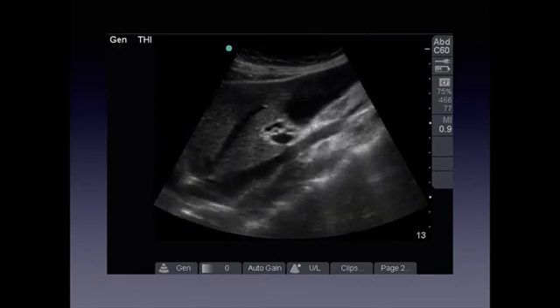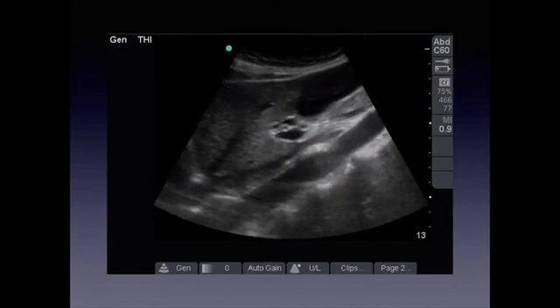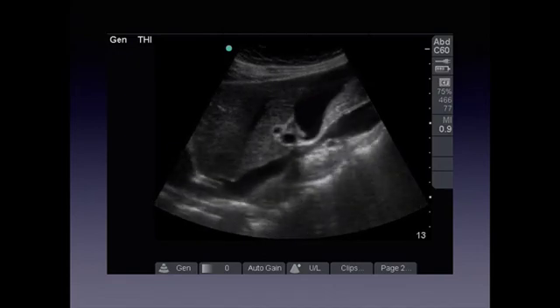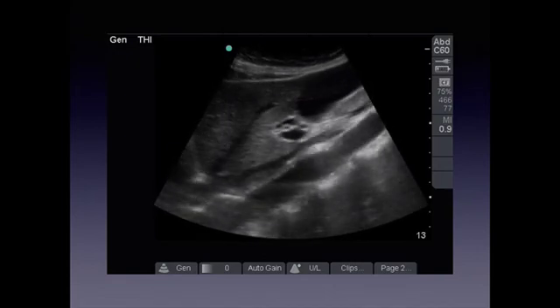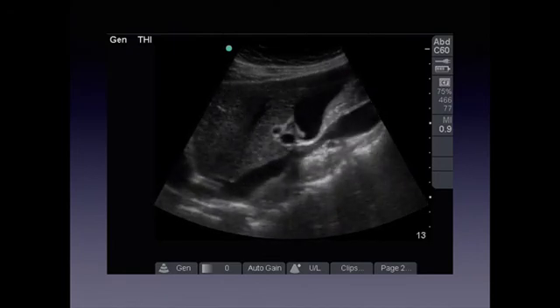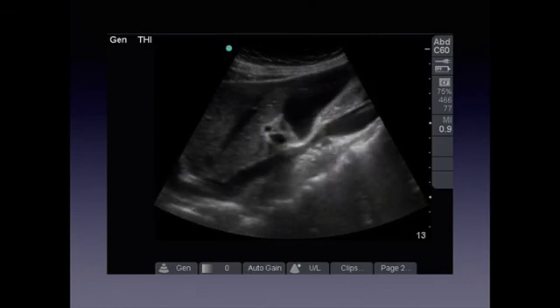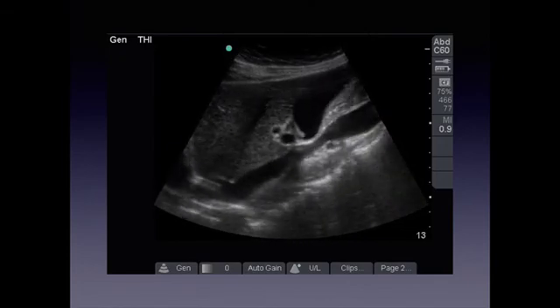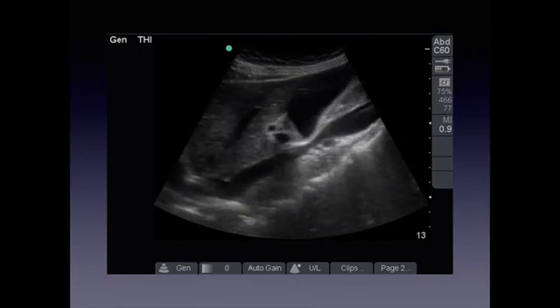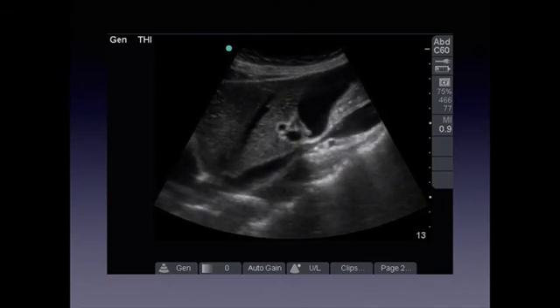You can see the first hepatic branch of the IVC coming off. You can see the IVC going up. And then above that, where those little white outlined circles are, that's the hyperechoic... Sorry, I'm blanking. It's the portal system. So the portal system is bright white.